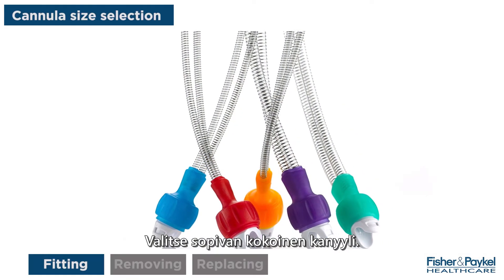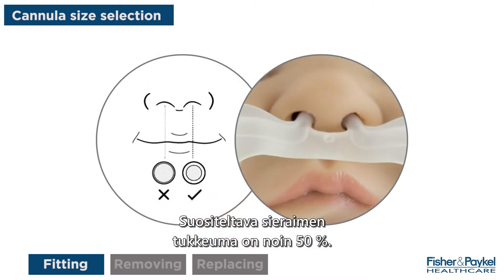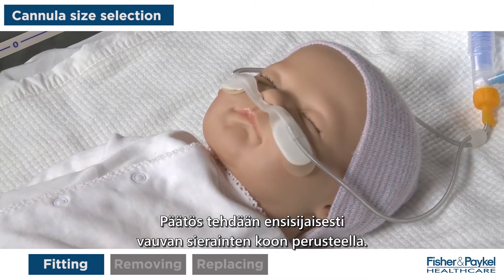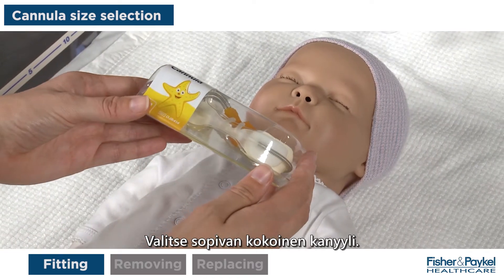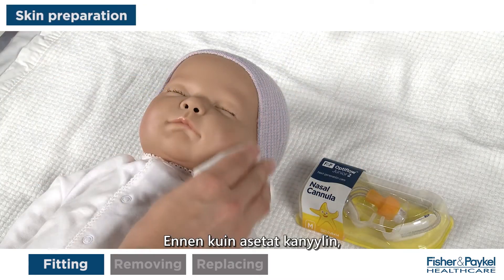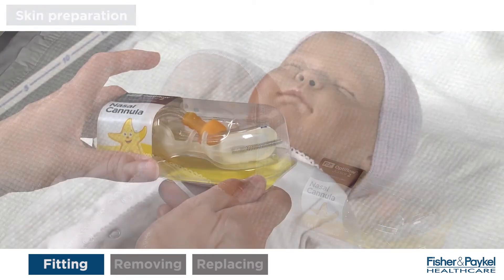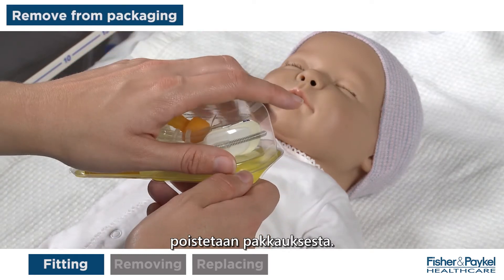Select the appropriate cannula size. Recommended nare occlusion is approximately 50%. Patient weight should only be used as a guide — the infant's nare should be the primary consideration. Choose the appropriate cannula size; in this case, the patient is a medium. Before application of the cannula, follow your hospital protocol for skin preparation.